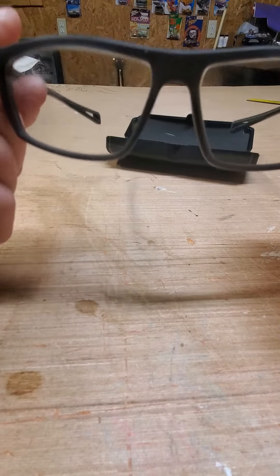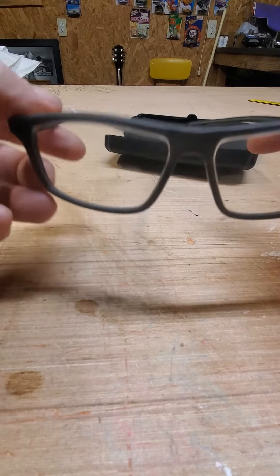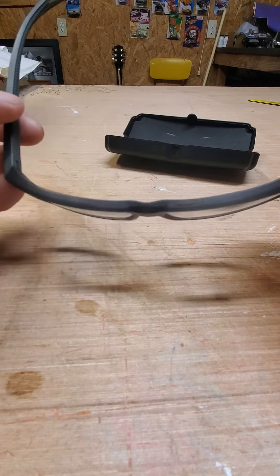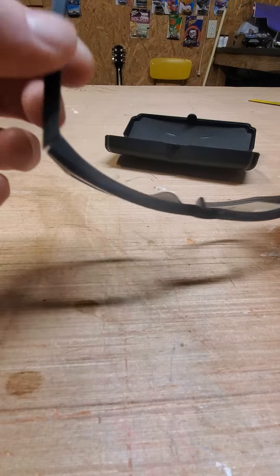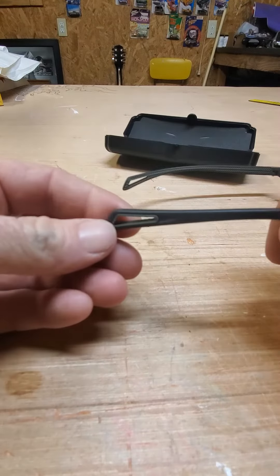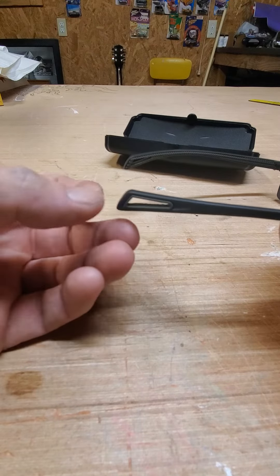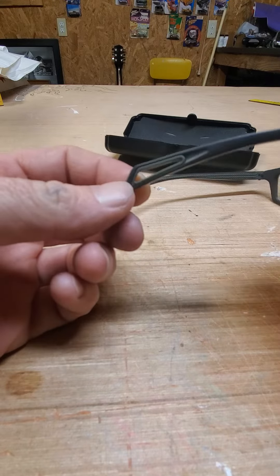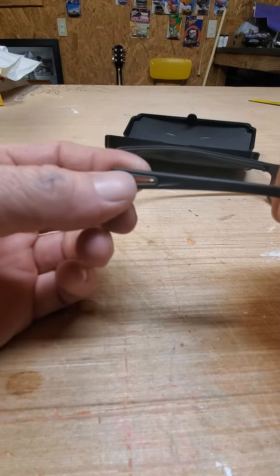I got the transition lenses — I believe it's the Crazo. They do pretty good for me. It's got a little hole right there where you can put a clip on, to hang glasses around your neck.